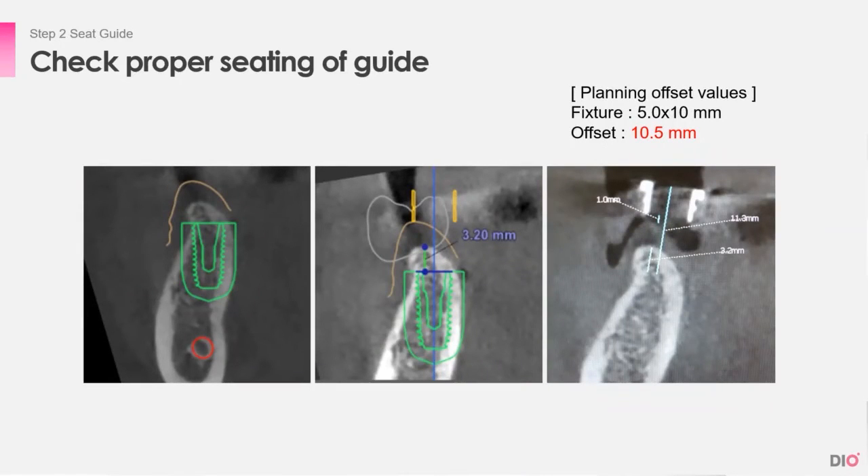Here is an example. Implant location is planned in the first CT, guide location and height is planned in the second CT, and the CT taken with the actual guide in place is the third CT. You can see that the offset is 11.3, but the actual planned offset was 10.5, which means the guide is not accurately seated on the teeth.